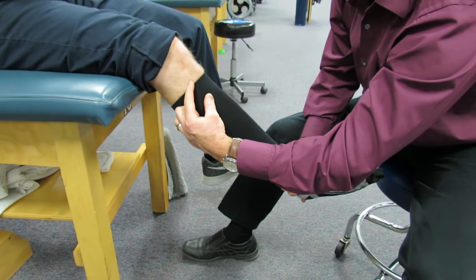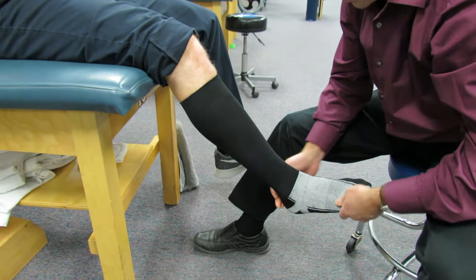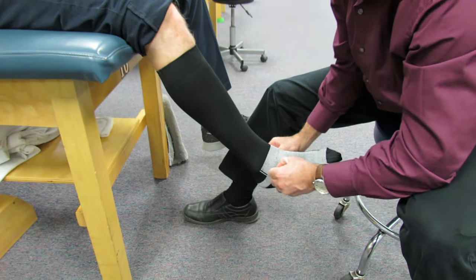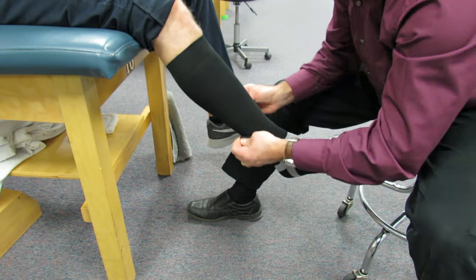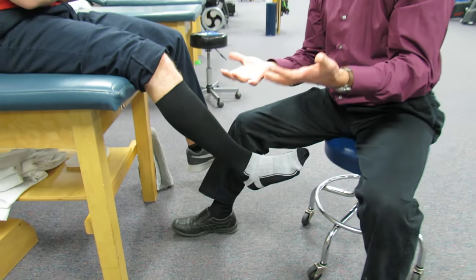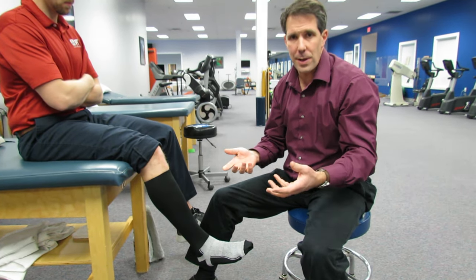A good compression sock will have a nice wide top to it so it doesn't dig into the skin and cause a tourniquet effect. Then you can just adjust the sock as you go. You want to take all of the wrinkles out of it. Another little tidbit of information that can make life a lot easier is wearing a pair of rubber gloves — like those yellow rubber gloves that you use to clean the toilet with.